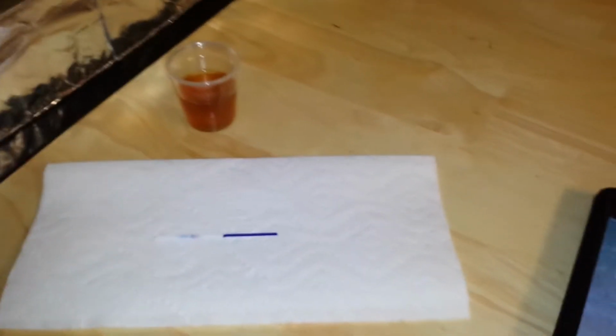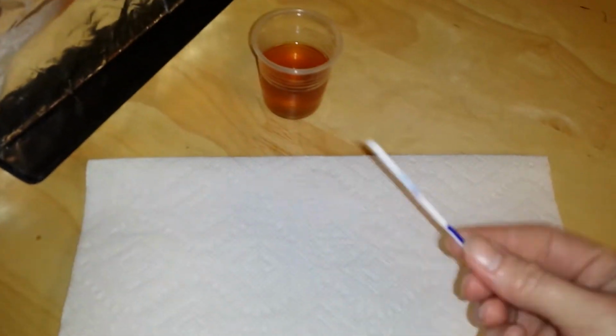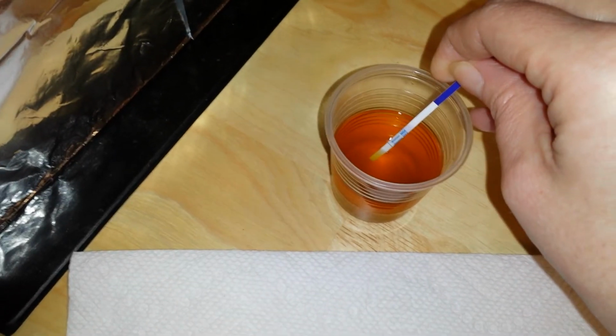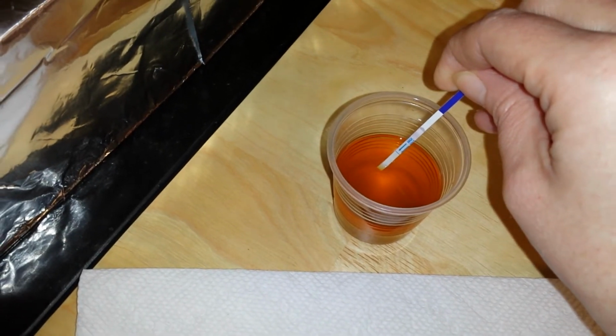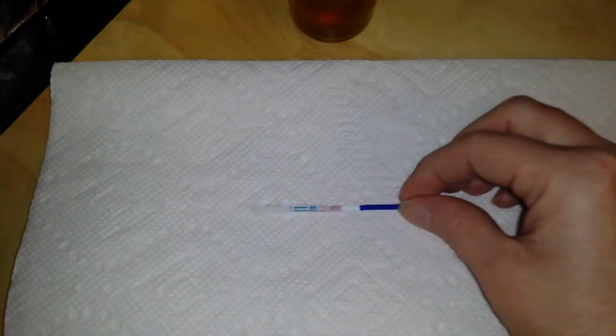Okay, so with that being said, now that I've gone over all that and you know how this works, essentially the same way as any other pregnancy test would, I'm going to go ahead and dip this. I like to do it for about 5 to 10 seconds, but really until I see the dye coming up. And then I'll take it out. And there we go. And put that there.